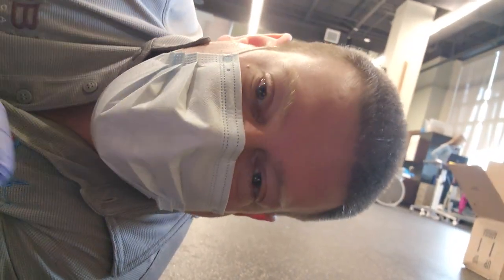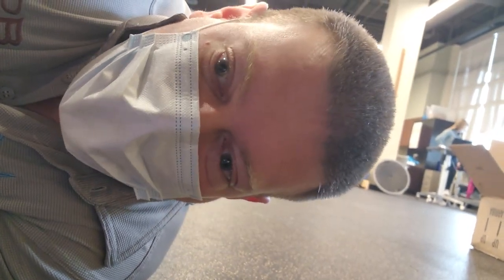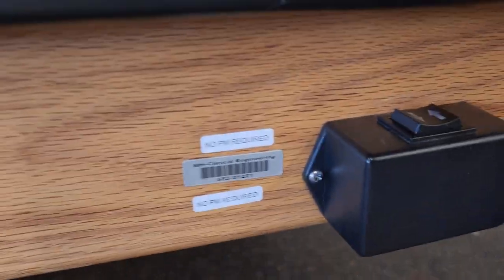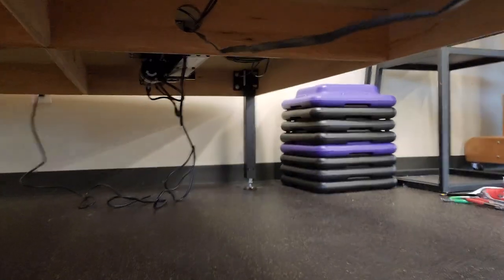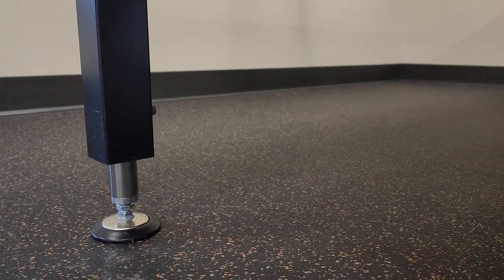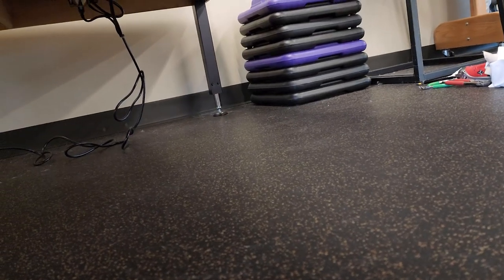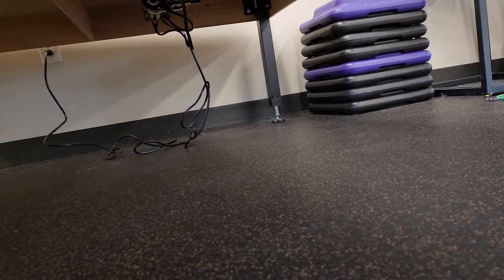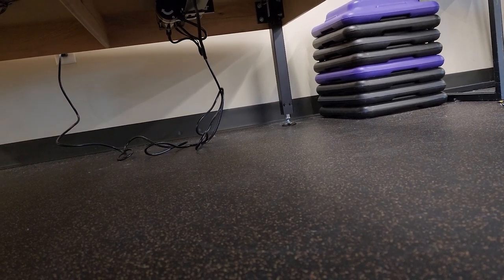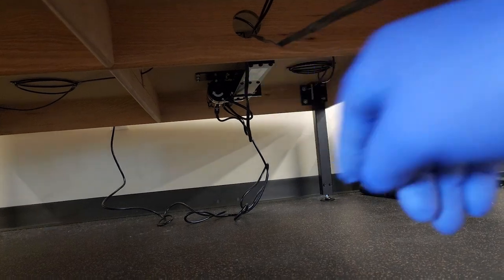So we got everything swapped out and we're ready to do our initial test. Let's see if all of our legs are currently running. So here's the switch. It's going down, going up, several times, because remember, there is going to be air in the system. And more importantly, we want to check and verify that none of our connections are leaking.